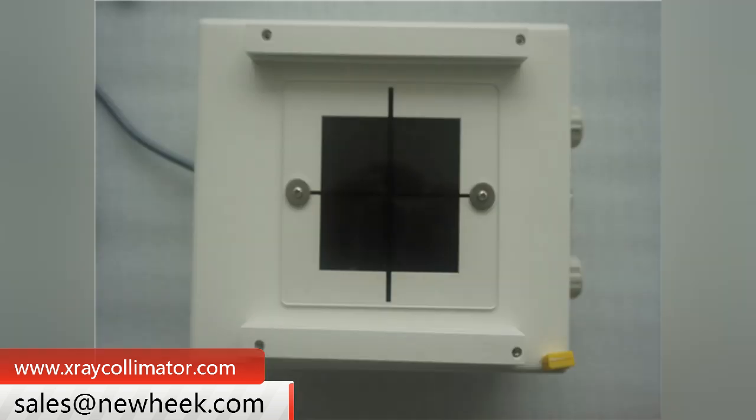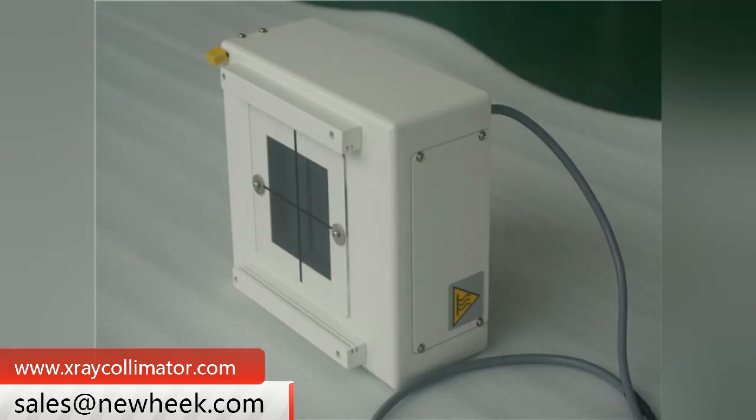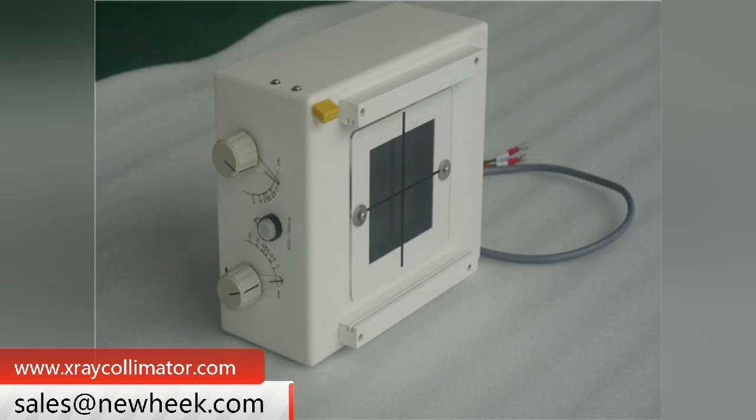In order to ensure that X-ray can be emitted quantitatively from the beam limiter, the outer walls of the beam limiter are all made of double-lined lead material.